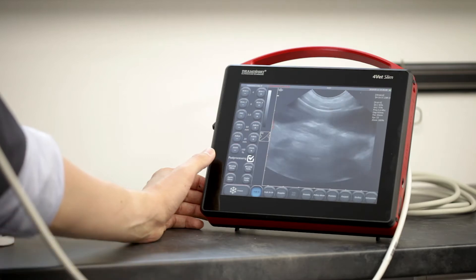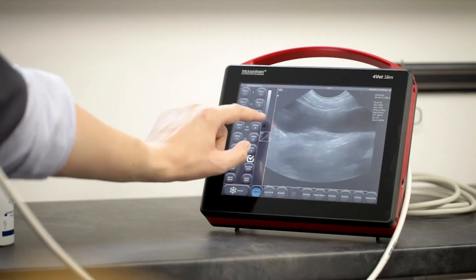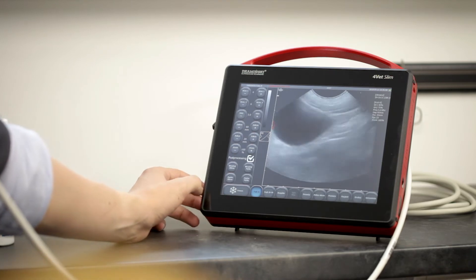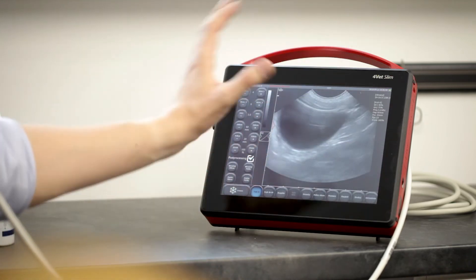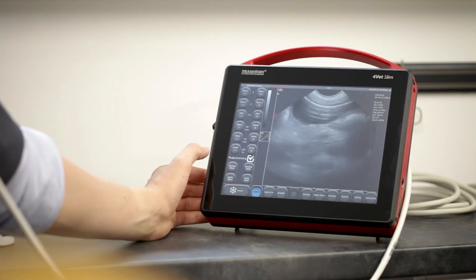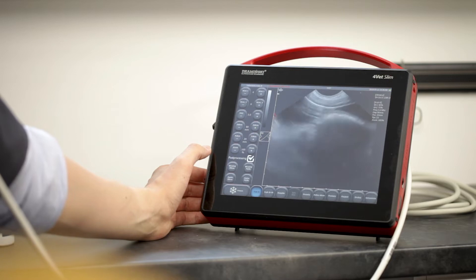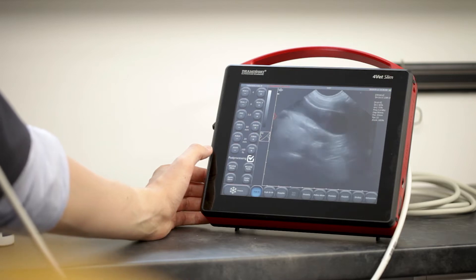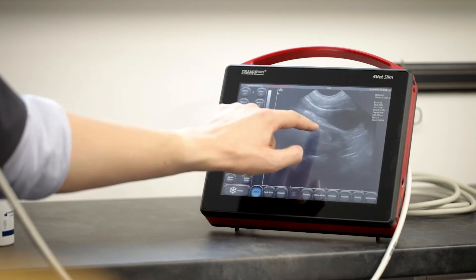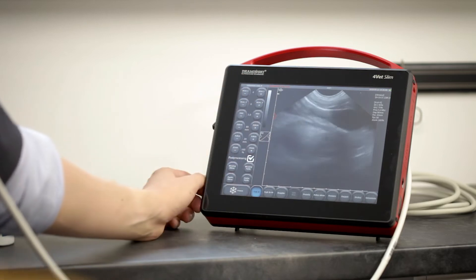Now, for example, when I want to see something below the urinary bladder I should adjust the depth of scanning. I increase the depth of scanning and here I'm looking for the uterus — it's here on the image as a hypoechoic structure.